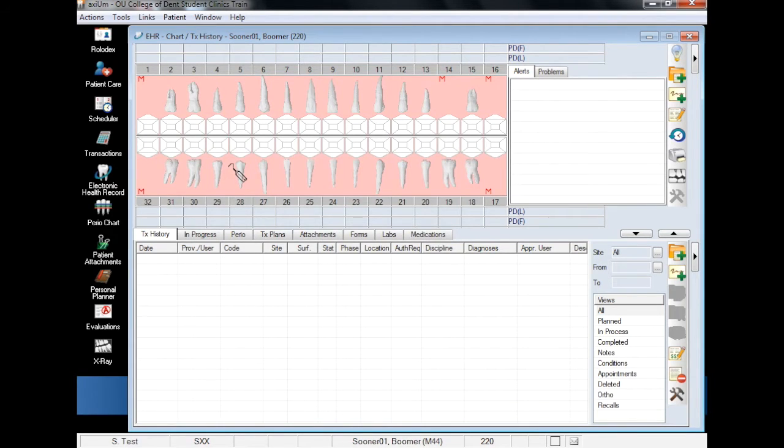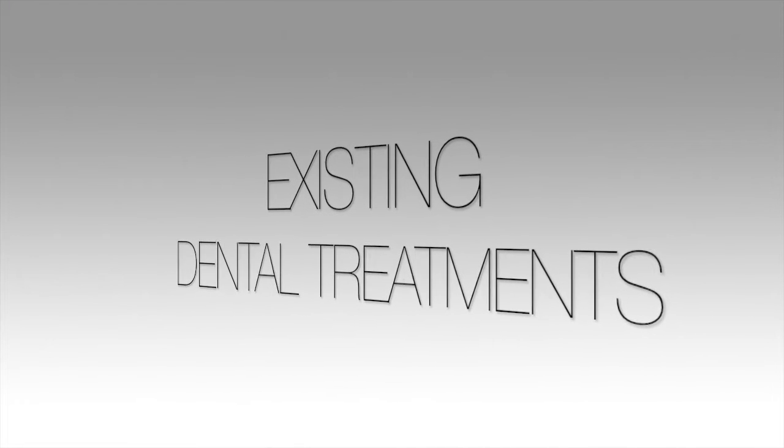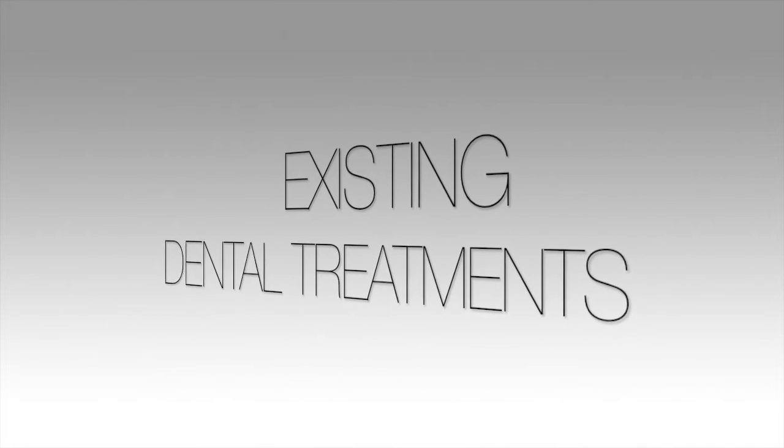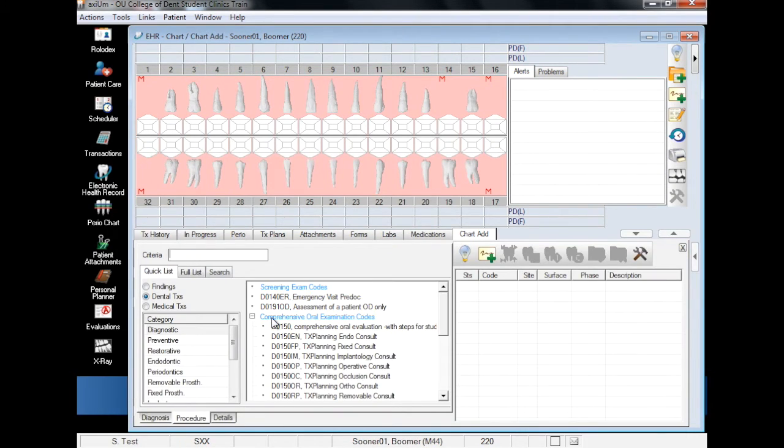Now that we have removed all of the missing teeth, we can begin charting existing treatments. With the Treatment History tab active, click on the folder with the green plus on the right side of the page. This will create a Chart Add tab where you will input your findings.